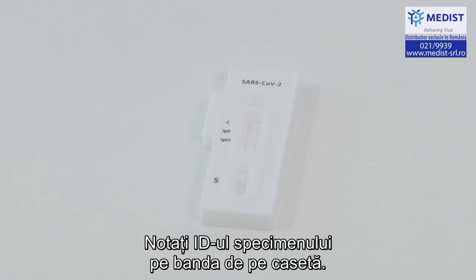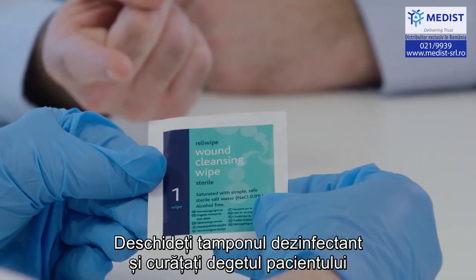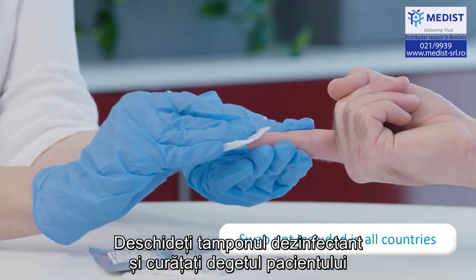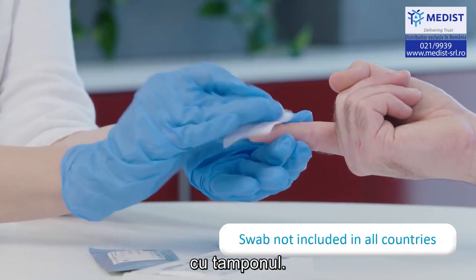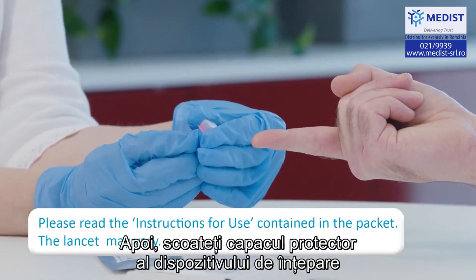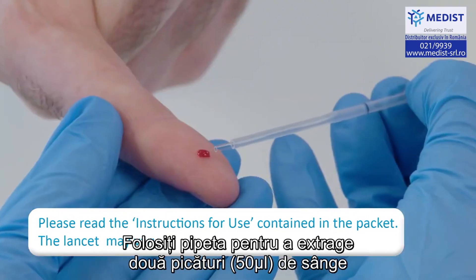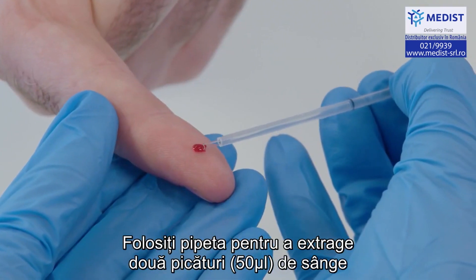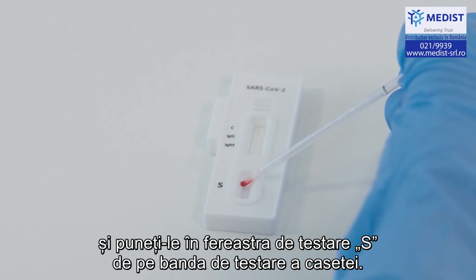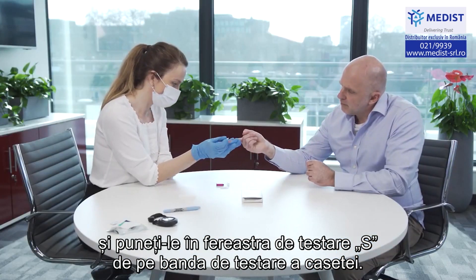Mark the test strip cassette with a specimen ID. Open the cleansing swab and cleanse the subject's finger with the swab. Next, remove the protective cap from the lancet and use the lancet to draw fingertip blood. Use the pipette to draw two drops of blood and place them into the specimen window S on the test strip cassette.